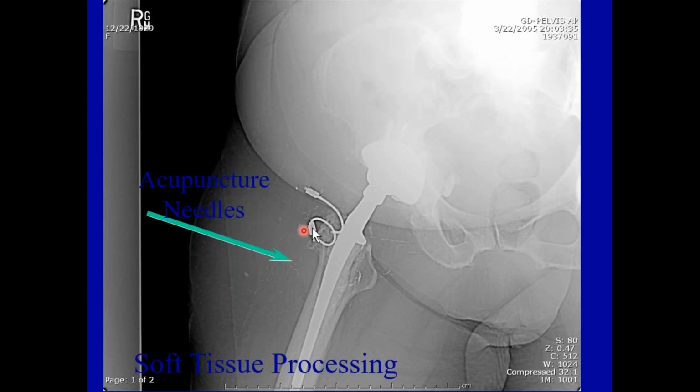So there's metal artifact. This would have been in the treatment phase. So this patient has had some previous attempts at therapy. Some reason for, just help me with my hip pain. So they chose acupuncture. Well, unfortunately, part of the acupuncture needles were left behind when they were removed, as I said, and they have a hip replacement.